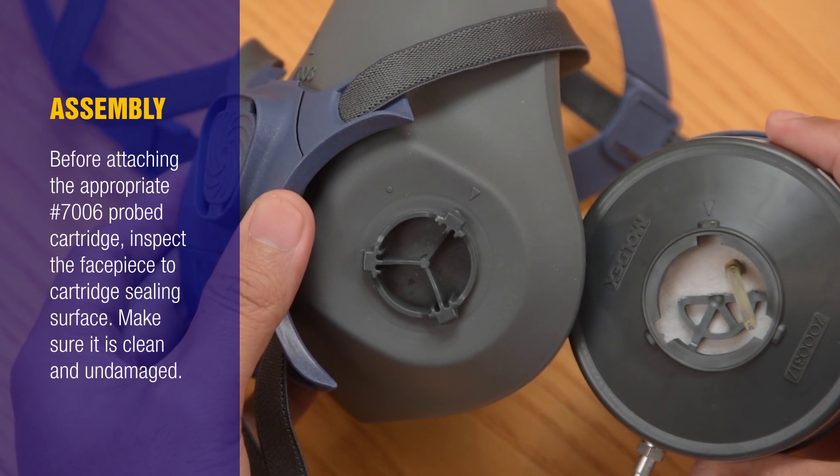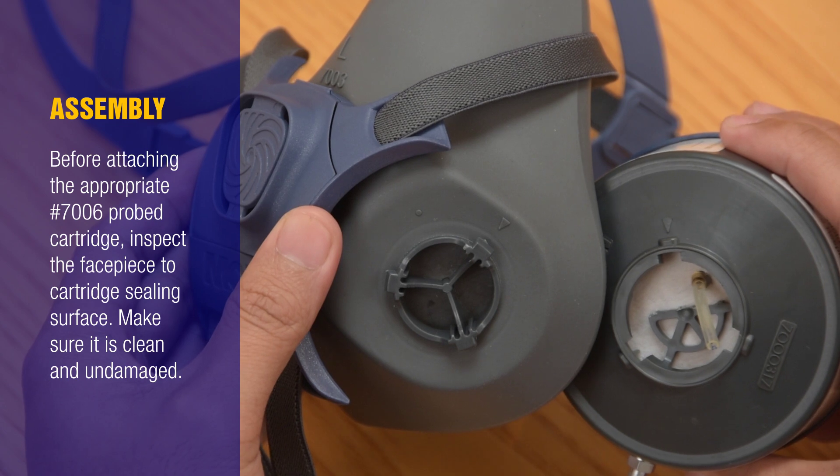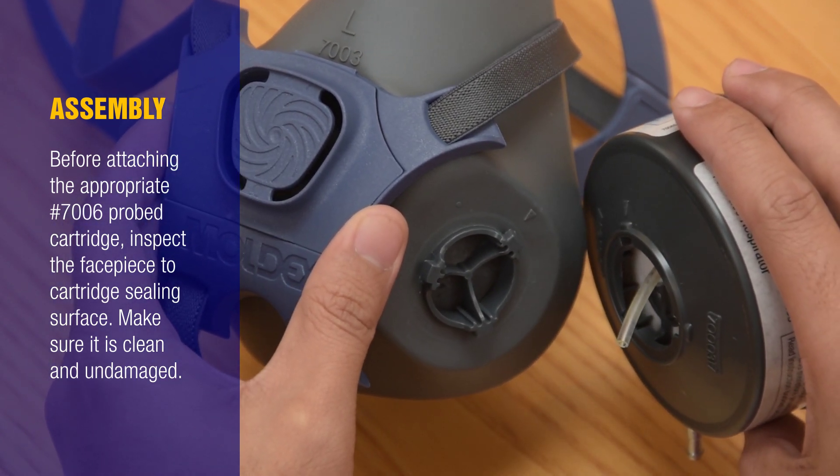Assembly: Before attaching the appropriate 7006 Probed Cartridge, inspect the face piece to cartridge sealing surface. Make sure it's clean and undamaged.